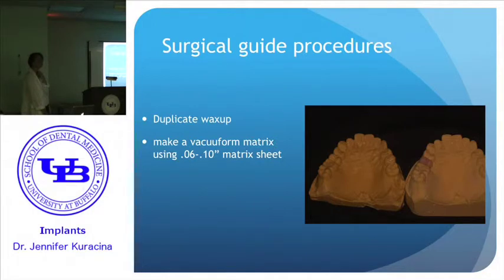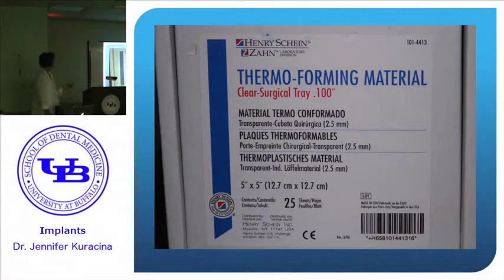2 millimeters? Yeah. That's really thick. That's what Dr. Buhai recommended. Oh, this is in inches. That may be why. All right, so this is the stuff we happen to use in our office, so that's 0.1 inches. And I don't know off the top, oh, here, 2.5 millimeters, okay.